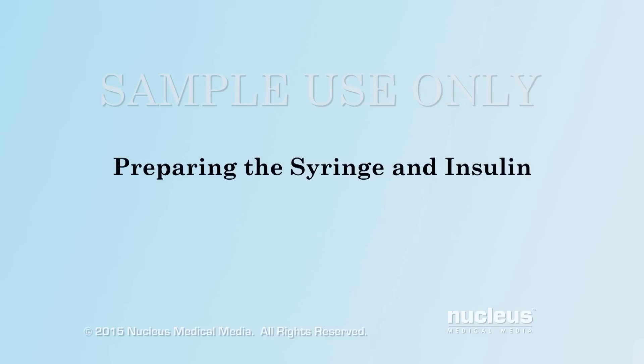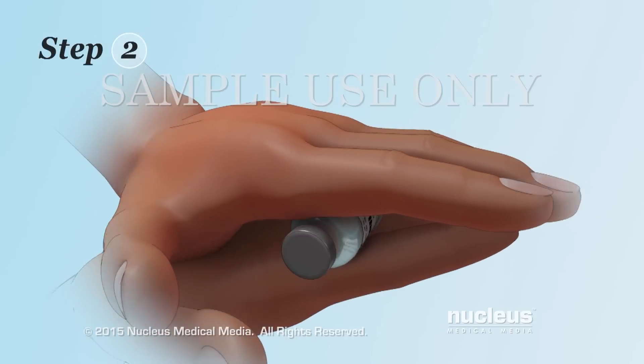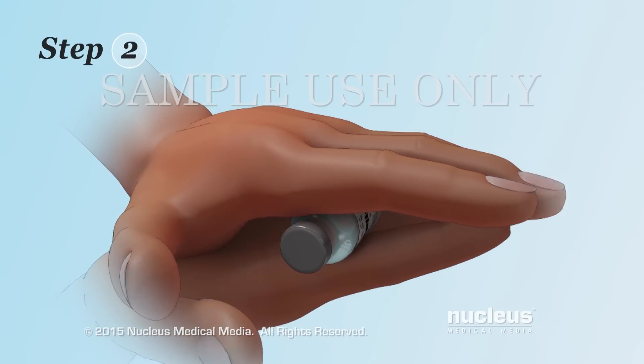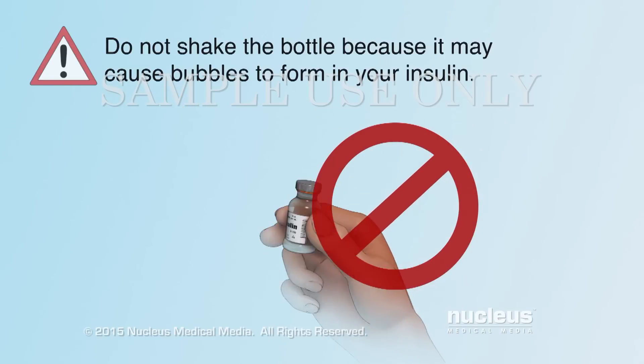Preparing the Syringe and Insulin. Step 1: Wash your hands with soap and water and then dry them. Step 2: If your insulin needs to be mixed, gently roll the bottle between your hands. Do not shake the bottle because it may cause bubbles to form in your insulin.